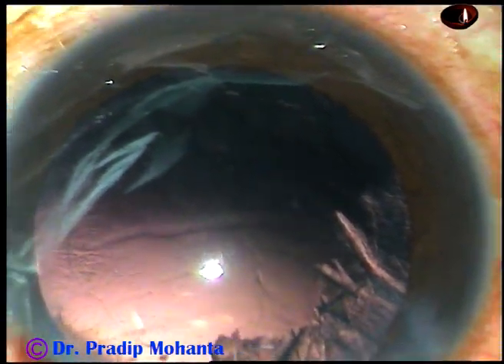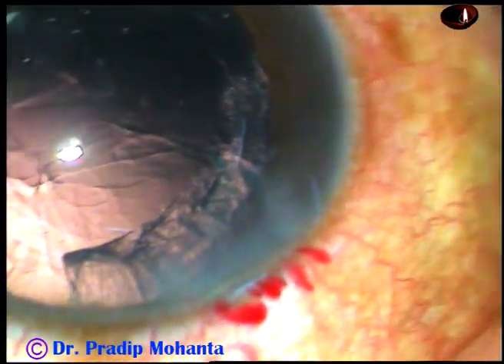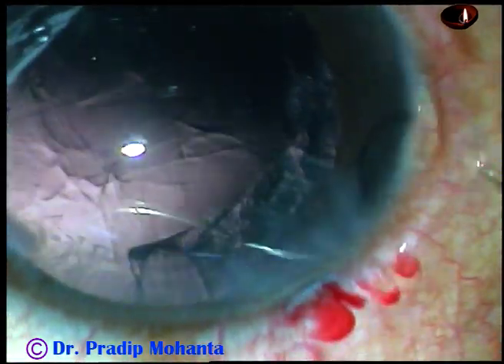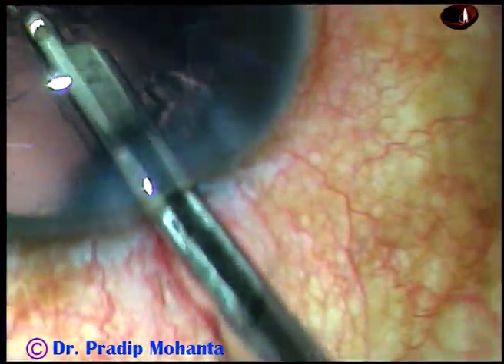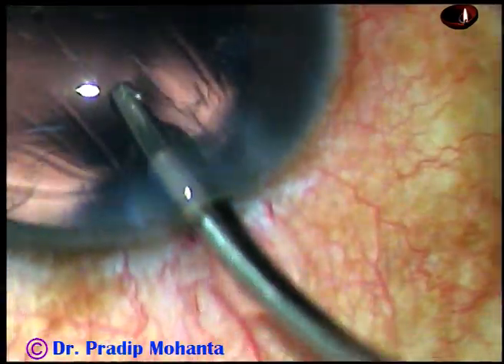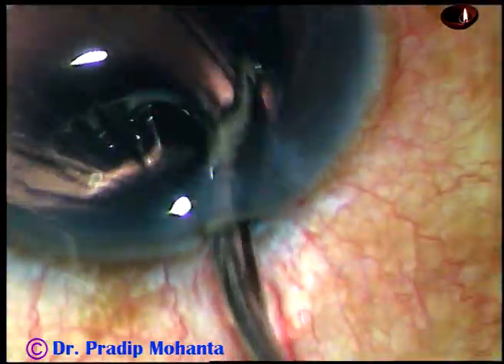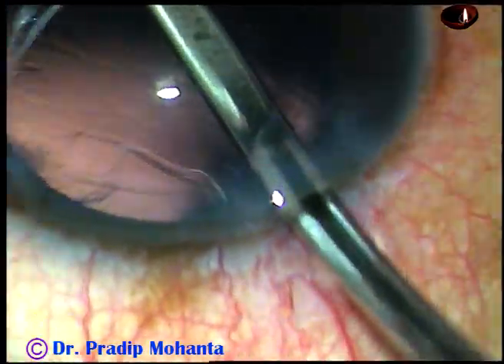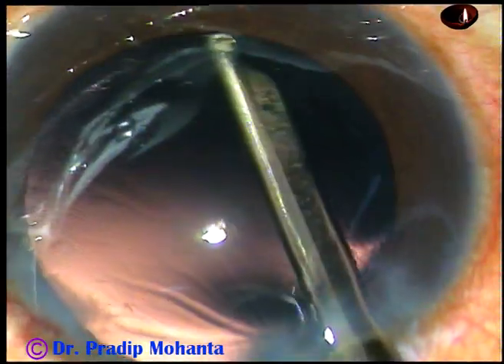I am going to use a Simcoe cannula — a 23-gauge Simcoe cannula for removal of cortical lens matter. The Simcoe cannula is much safer than automated instruments like bimanual irrigation-aspiration or coaxial irrigation-aspiration. But once you practice those things and know the nuances, they also become safe in your hands. The cortex has been nicely cleaned through the main port itself. I didn't have to go through the side port. The sub-incisional cortex has also been removed by the Simcoe cannula.